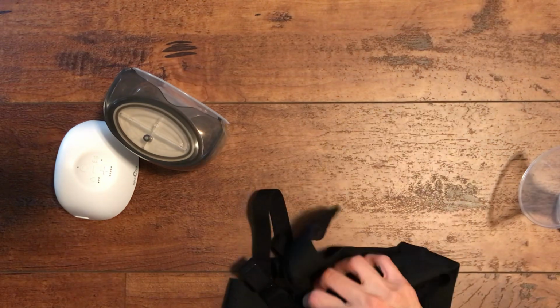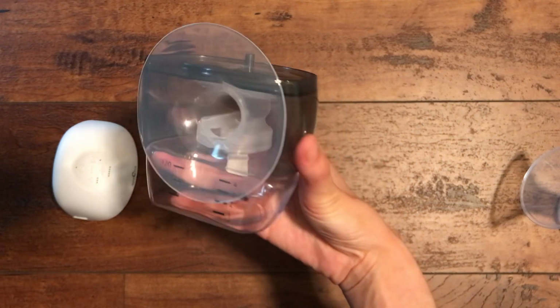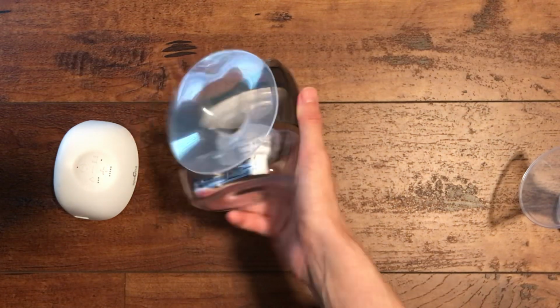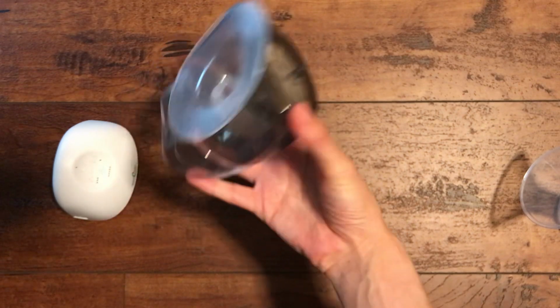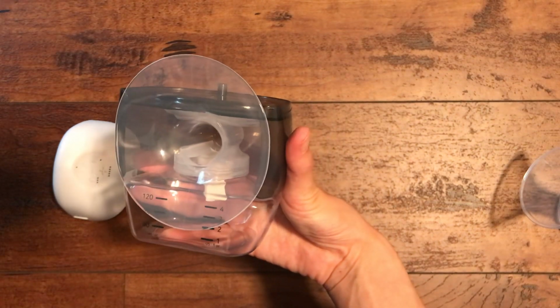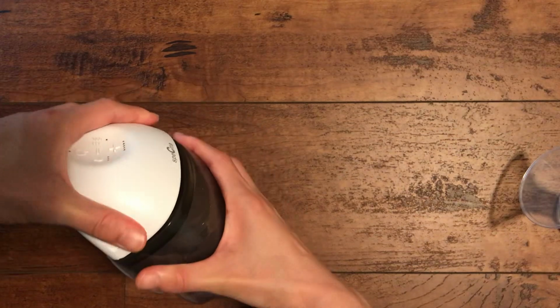So as long as you place it correctly in your bra and not let it move around too much, I think it'll work. But like I said, the fact that you can't really check your progress and make adjustments midway, that's one of the downsides. But I feel like if you get the hang of it, you'll be able to do it successfully.